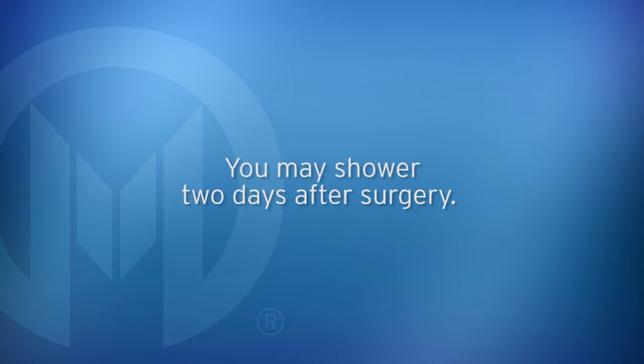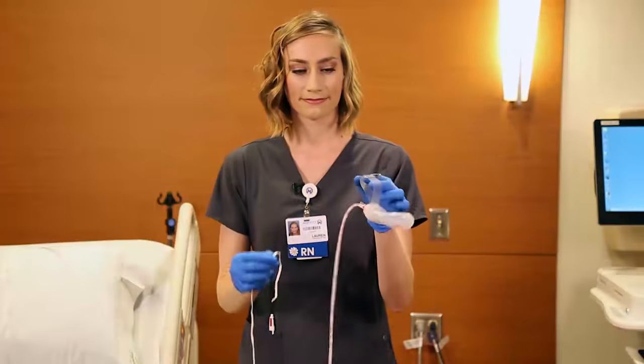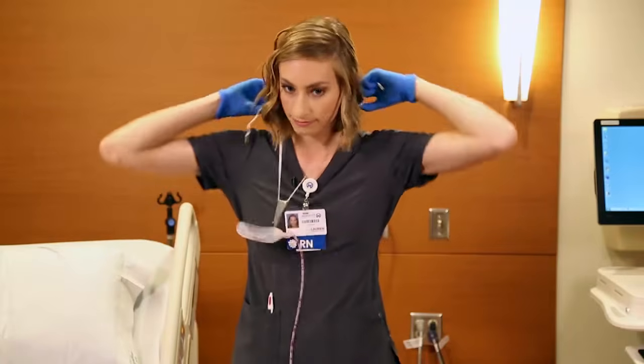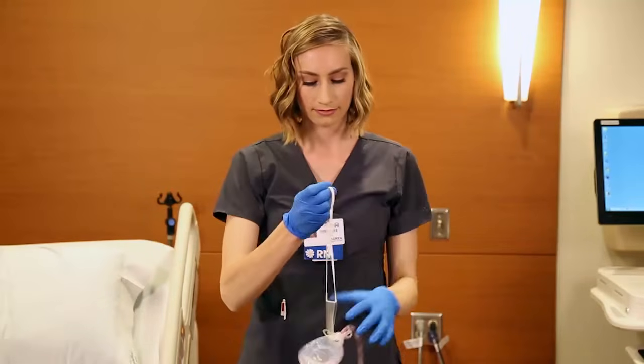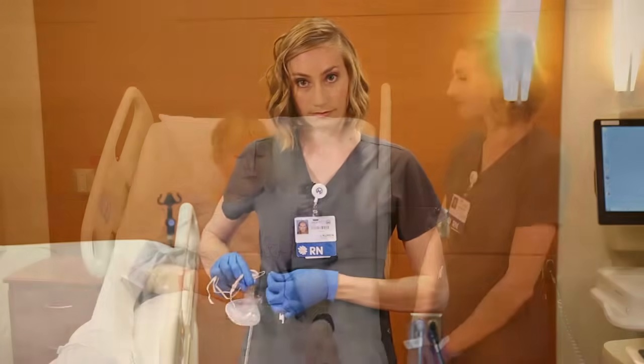You may shower 2 days after surgery. The drain site should be cleaned and redressed daily. Follow your doctor's specific instructions on how to do this. Always secure the drain properly. For showering, hang it around your neck. After showering, you may hang it around your neck or pin it to your clothing.